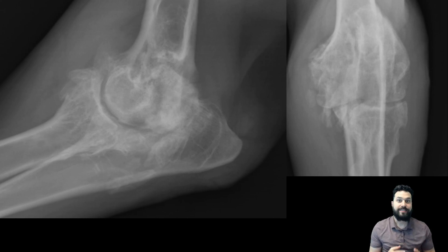So what are the findings that we're seeing here? This elbow has a significant amount of periarticular bone proliferation. It's present at multiple points — it's along the margins of the anconeal process, it's along the radial head, and it's at the medial aspect of the joint both in the joint space itself and at the level of the medial epicondyle.